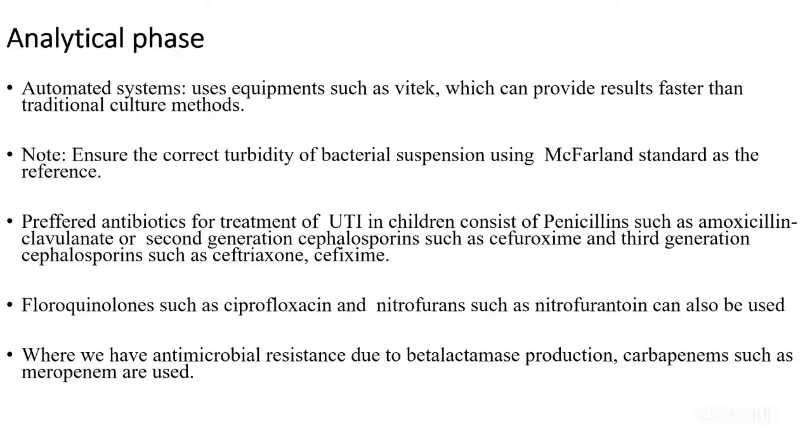Let's say the minimum inhibitory concentration for a drug like cefotaxime, the equipment runs dilutions, and the minimum concentration of the drug that can inhibit the organism is 0.5. It will tabulate for you on a table that the minimum concentration was 0.5. Let's say the breakpoint was 1. It will tell you this organism was sensitive to the drug. It will do the tabulations for you. You'll just receive a report that the organism is sensitive or resistant to the drug.